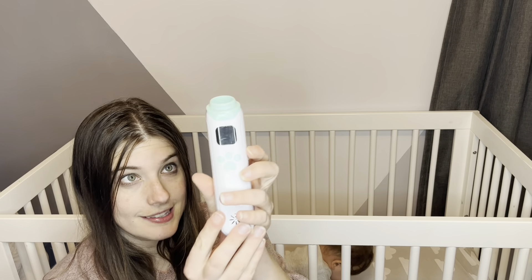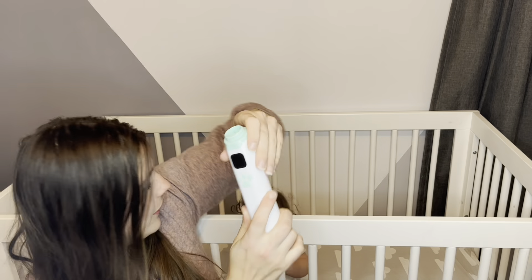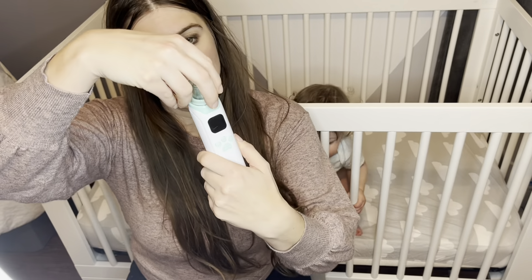Let's go ahead and take it out of the box and see what we have. Here is the actual tool itself. Notice it is white with green. It also has a mucus cup that you put on the top.